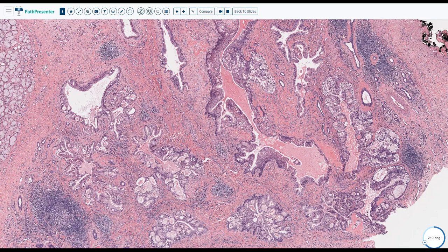Histologically you see mucinous, epidermoid and intermediate cells, and you want to be sure that this is not a metastatic squamous cell carcinoma, based on what we discussed, keratinization and intercellular bridges. Usually with a clear margin the patient has a very good prognosis, really very good prognosis.